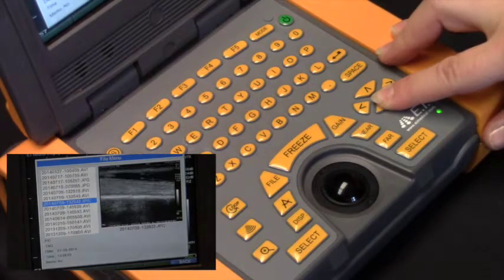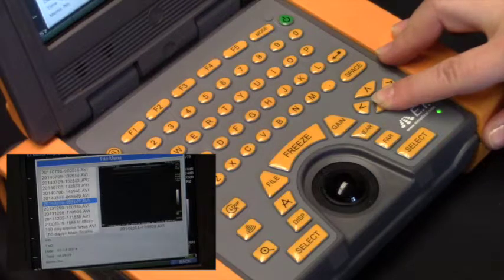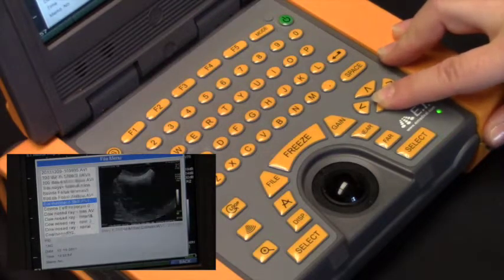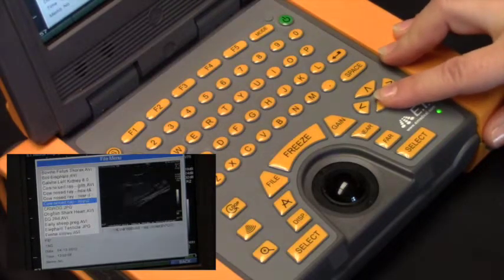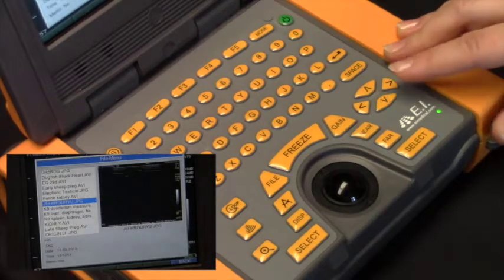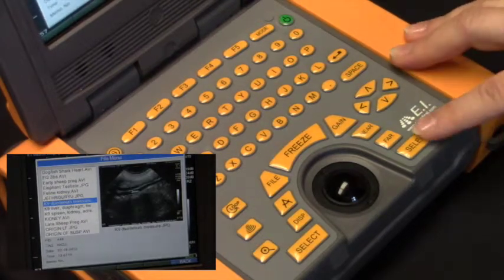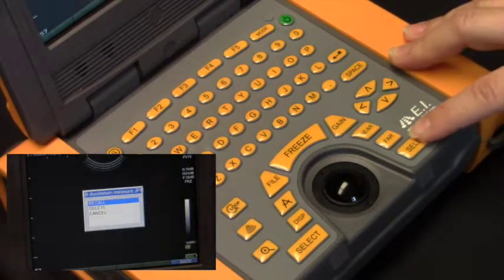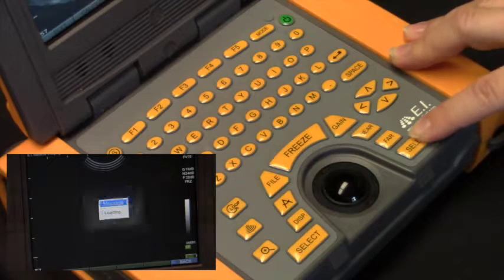You can use your arrow key to scroll down through the menu. Once you have found the image that you would like to recall, simply hit the select key and then select again to recall the image.